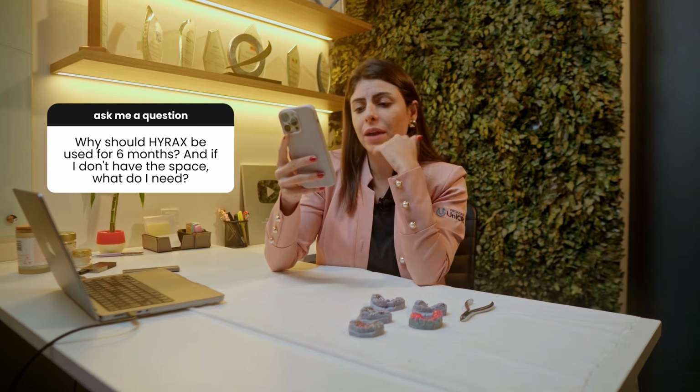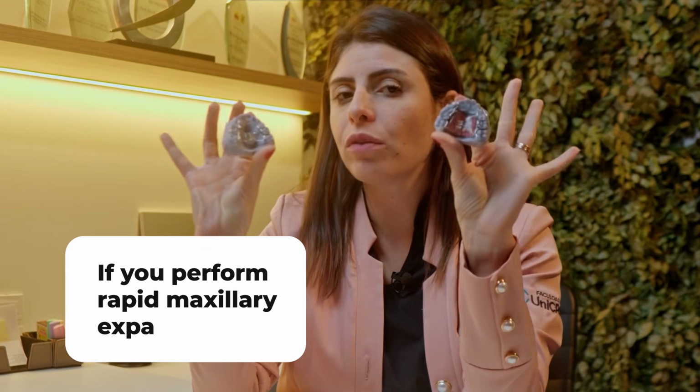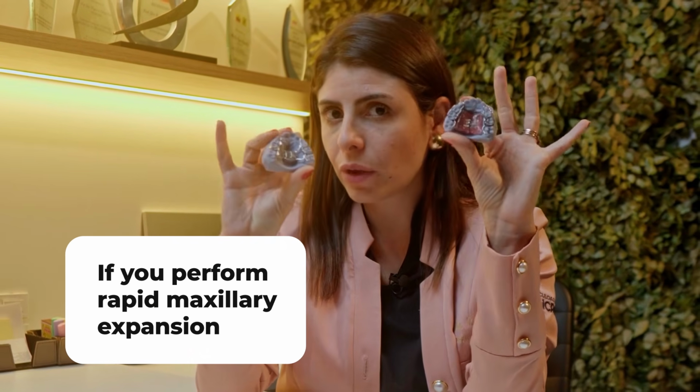Okay, answered? Next question, Romy's question, who asks, why should a Hyrax be used for 6 months? And what if I still don't have the space I need? Well, first of all, we should use the Hyrax for 6 months, and this is valid for both Hyrax and Haas if you're doing a rapid maxillary expansion, okay?